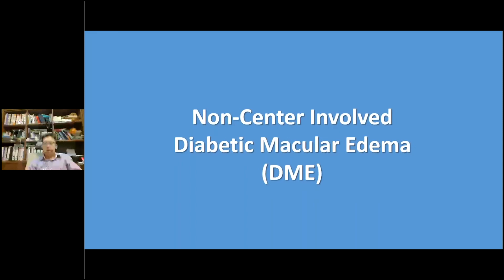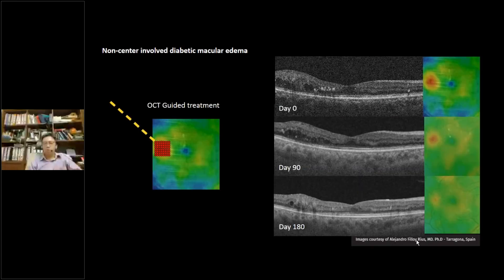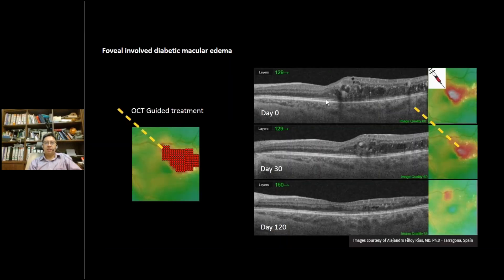Some clinical examples — with images courtesy of Dr. Ruiz from Spain. A patient with non-centre-involving diabetic macular edema received subliminal laser to the thickened areas on OCT, and at six months post single treatment, there is resolution of the macular edema. For fovea-involving macular edema, anti-VEGF is given first to reduce thickness, reviewed at one month, thickened areas treated with subliminal laser, and three months later — after just one anti-VEGF and one subliminal laser session — there is good resolution of the diabetic macular edema.